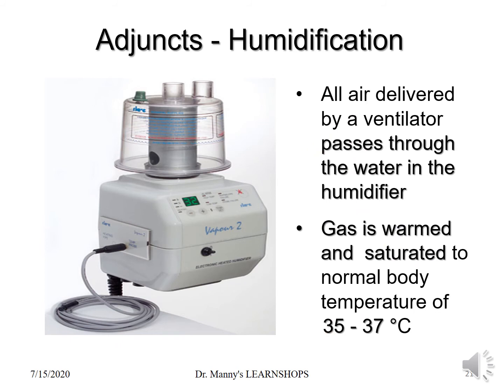You've got adjuncts that require humidification, where all air delivered by the ventilator passes through the water, sterile water, in a humidifier, and gas is warmed and saturated to a normal body temperature, typically between 35 and 37 degrees centigrade.